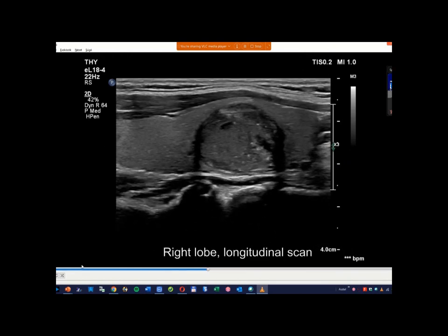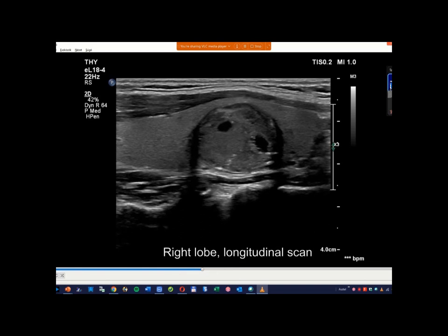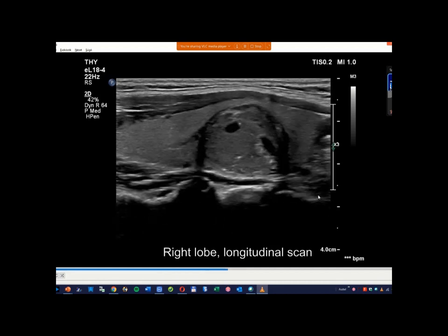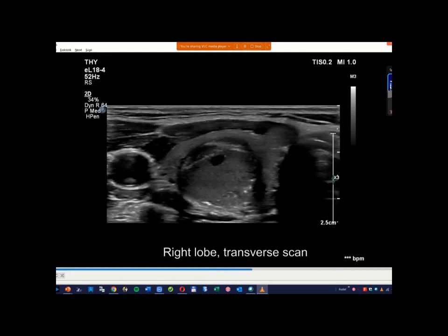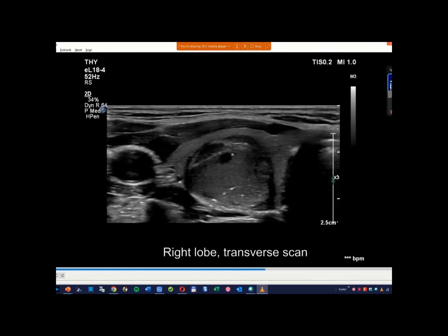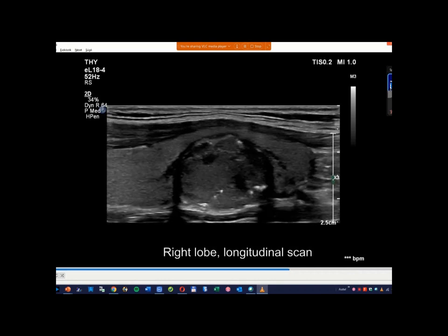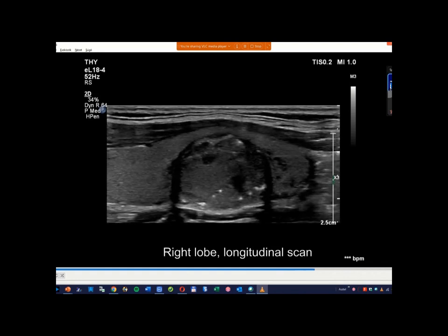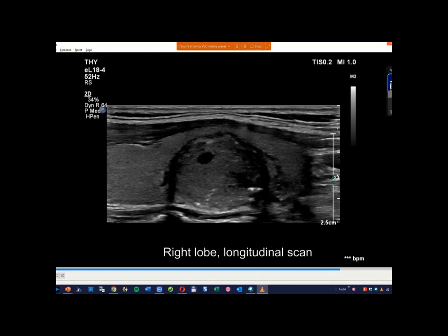Okay, I go back to the relevant part. Please focus on that figure. This is a typical cometary artifact. And also I guess that this can be one, and there are some others. At first sight, this is a very suspicious nodule because of the not quite regular borders and the possible taller than wide shape. Also, at first sight, the granules clearly prevail over lines. So the issue is not the great presence of bright figures, but whether these figures are cometary artifacts or can be microcalcifications.